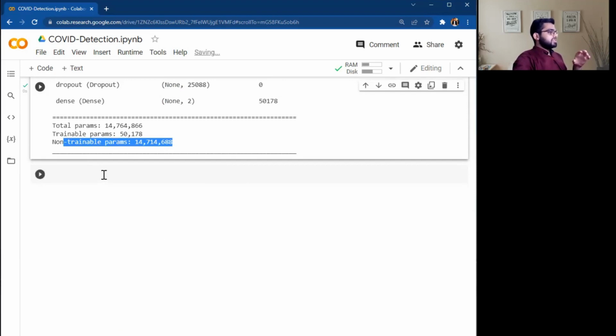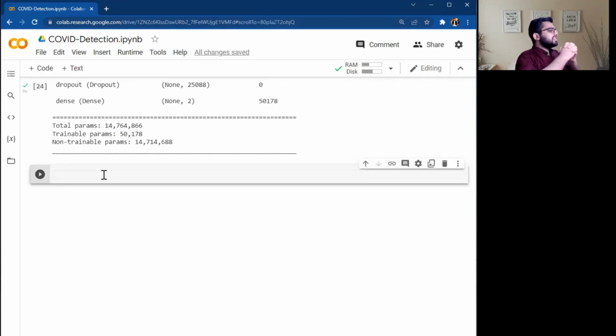Okay, now we'll perform some data augmentation. So what is data augmentation? Data augmentation is a strategy that increases the diversity of data available for training without collecting new data. For example, we crop the image, we rotate the image. Say this is my face, the first image. The second image would be my face with a horizontal flip, vertical flip, or flip at 45 degrees. Just like we change our images, we create diversity in our training data set.